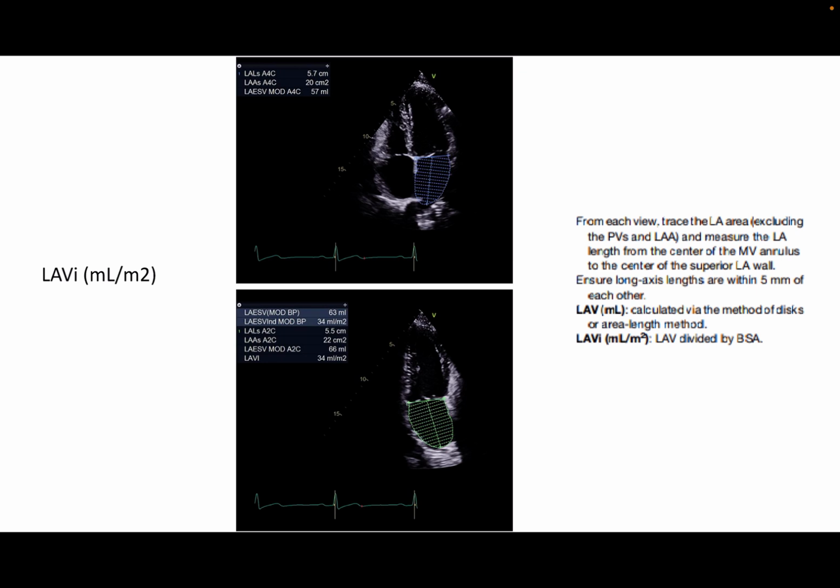Clinical pearl: LAVI greater than 34 in a patient without these exclusions is a red flag. It means they had elevated filling pressure long enough for a structural remodel. Even if today's echo parameters are borderline, the LA remembers the chronically elevated pressure.